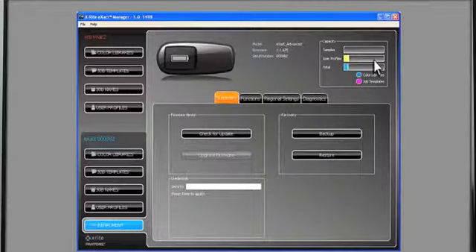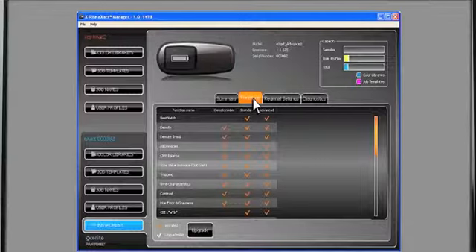Your backup will be stored in a file with a default name displaying the device name, time, and date of your backup. Under the Functions tab, you will be able to see all of the available functions for the 3 different Exact types. The type of checkmark displays the status of the function. Some functions can be upgraded using the Upgrade button.